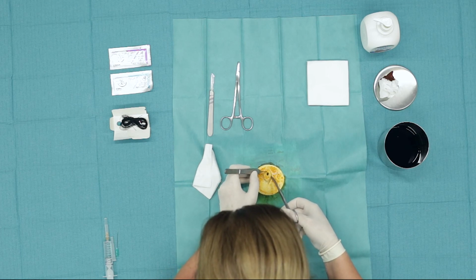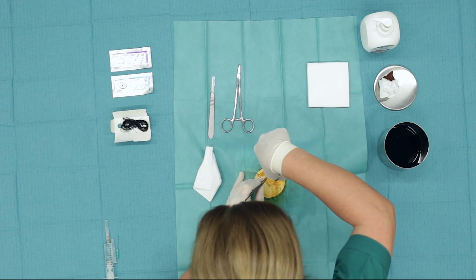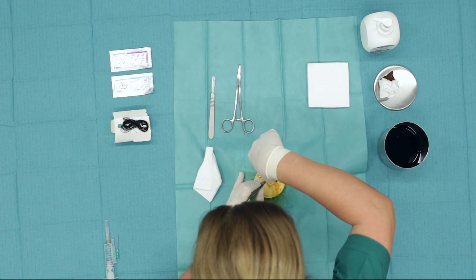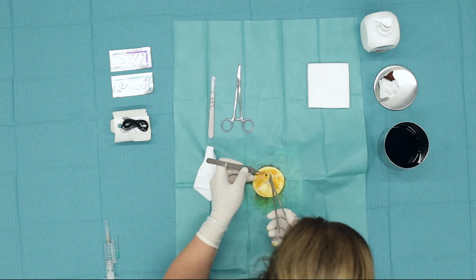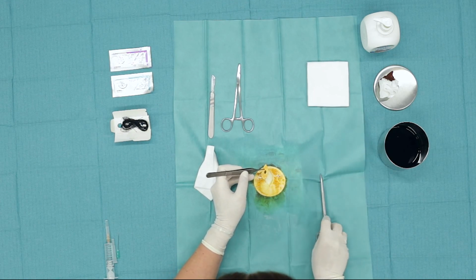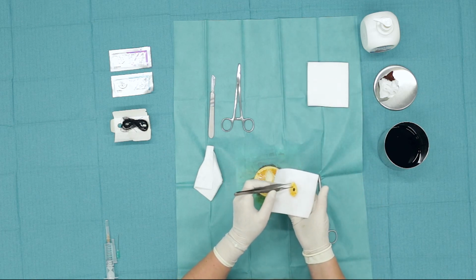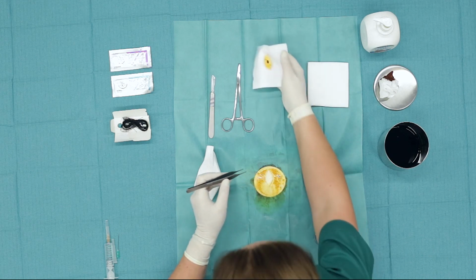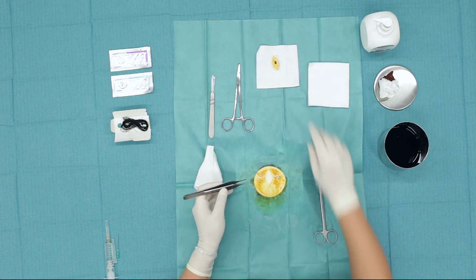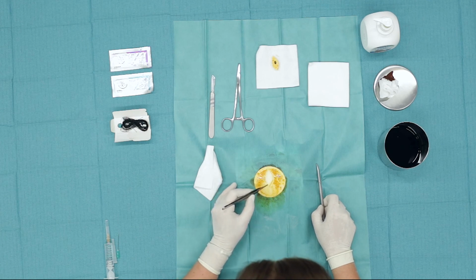In this way, without much contact of the forceps with the formation that I remove, the removal of the formation is done, which after being completely excised will be sent for histological examination. The created surface must be closed.